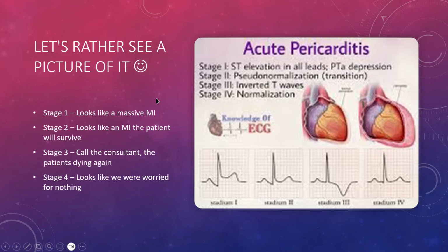So the one that's most commonly seen in the emergency department is stage 1. For those of you who move on to do medicine, internal medicine or cardiology, you likely see stage 2 and 3. And please remember stage 3 because I have seen people suddenly start to panic when they see this, thinking that something is going wrong. But it's purely a recovery of the epicardium that causes that. So I hope that makes sense to everybody.